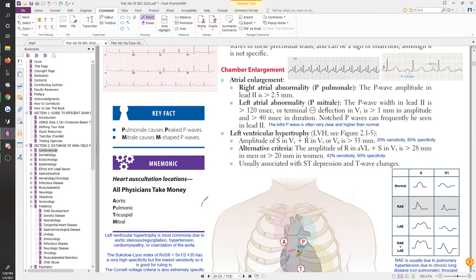Normally you would look for a tiny P wave, and then you have your big QRS, right? That's what you look for, and then you get your T. The P is almost equally as tall as the QRS complex. That doesn't happen. You don't get a P wave that's also equally as tall as your QRS complex, right? That looks very abnormal. You can see how your P and QRS are looking almost the same height. That's not very real. So when you start seeing that, you think of P pulmonale, P wave is too high, and you start thinking right atrial abnormality.